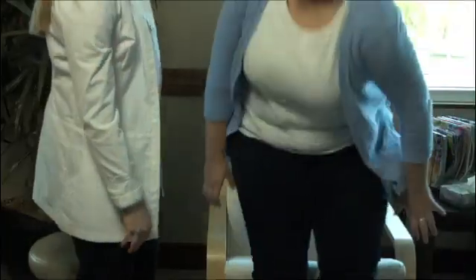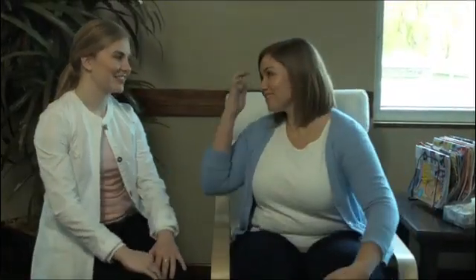For the Review to accurately measure the resting metabolic rate, or RMR, the patient needs to be in a true resting state. It is important that they be allowed to sit, recline, or lie down while testing.